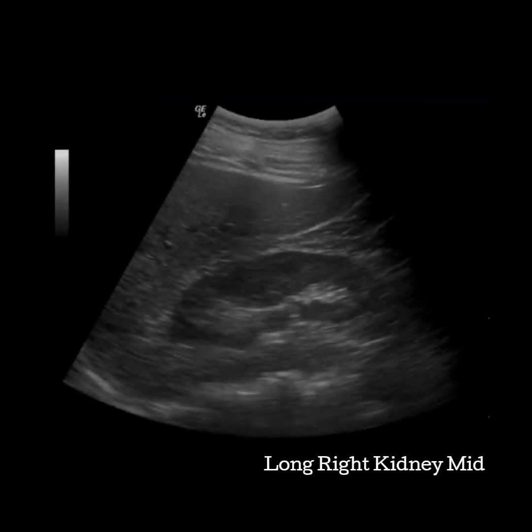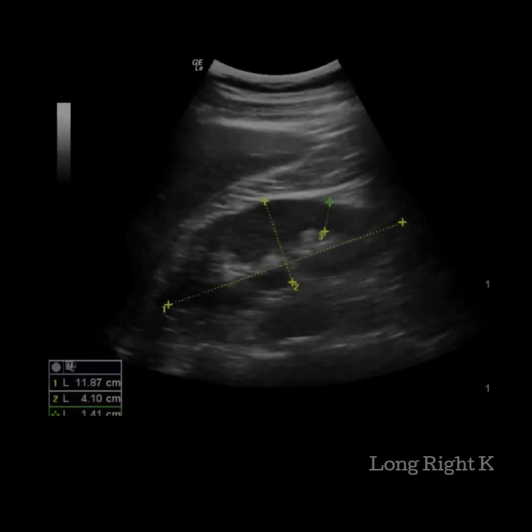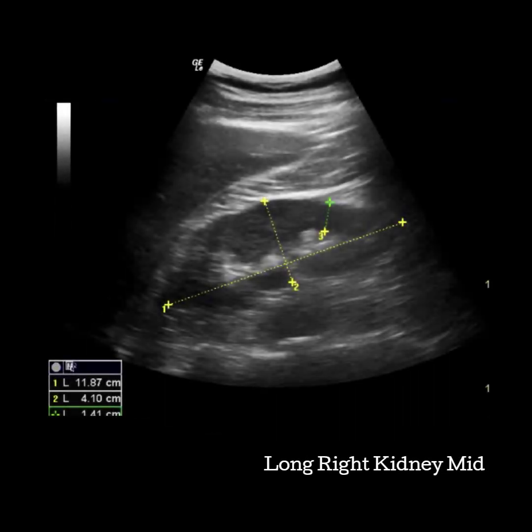To get back to mid, start sweeping or fanning the transducer away from you. Watch for the poles of the kidney to lengthen and become more pointy. The cortex of the kidney should be seen all the way around a sizable view of the sinus. You will measure this image in longitudinal and AP.